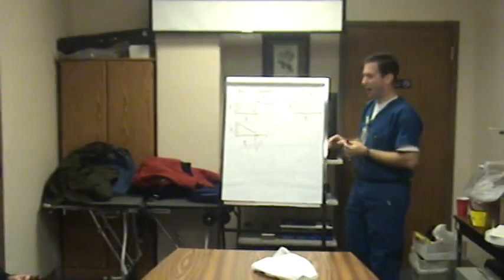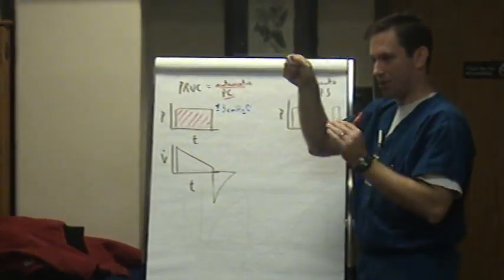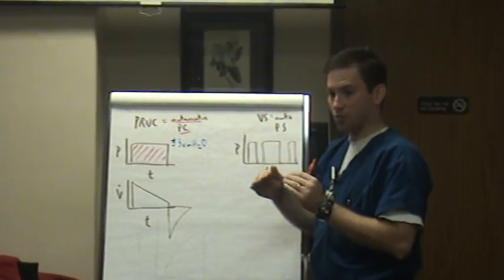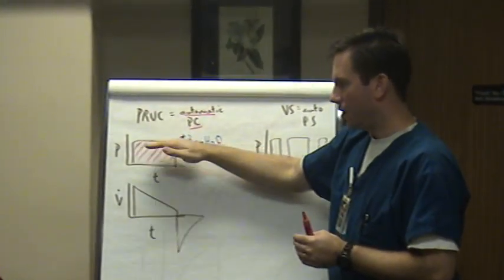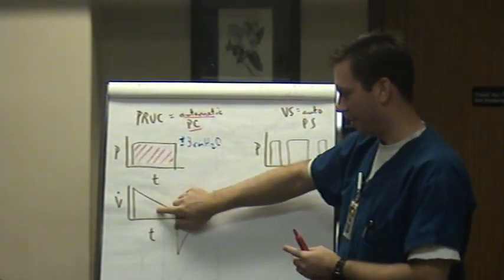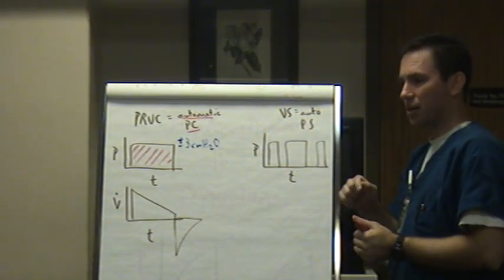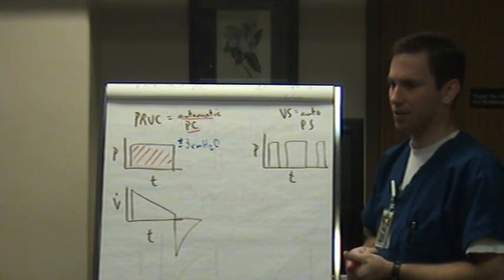But it's going to do it with less pressure than a volume breath because of this characteristic here. Now, I can control the pressures in PRVC, but your tidal volume is going to be locked out. For example, I can take my pressure limit knob and put it right above what the peaks are, and I'll keep it there, but your volume will suffer. But it does go up and down, so it's truly not controlling your pressure, but it's called a pressure control mode because it's delivering it with the pressure control characteristics, i.e. the flow waveform and the pressure waveform. But you're right, it still varies, but it's still going to be less than if you were in a volume mode, usually by at least 4 or 5 centimeters of water pressure.